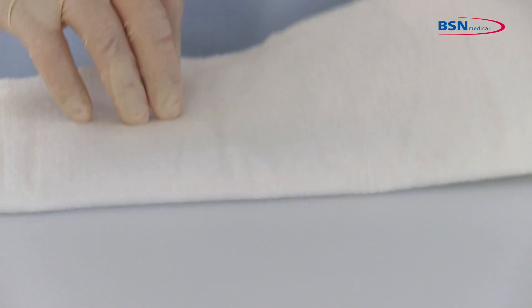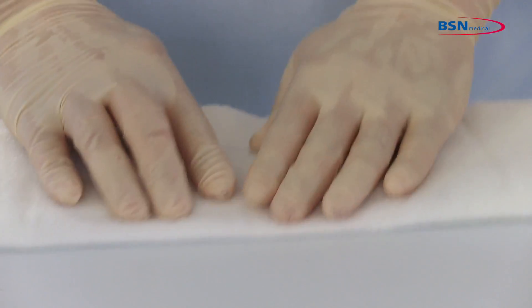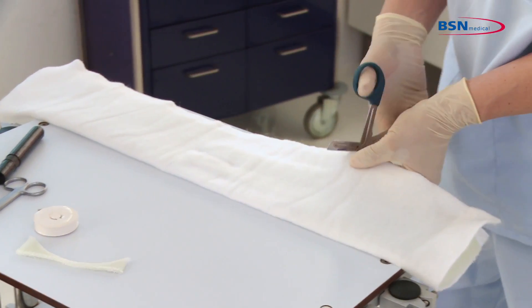Re-close the padding. Optionally, you can cut the butterfly wings out of the padding and leave a margin of padding on each side.